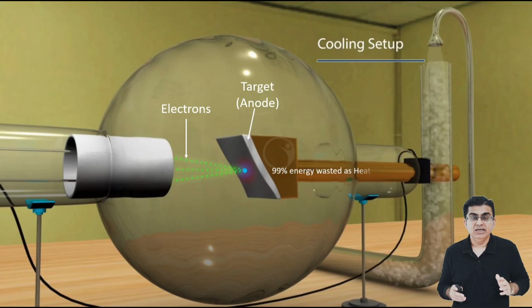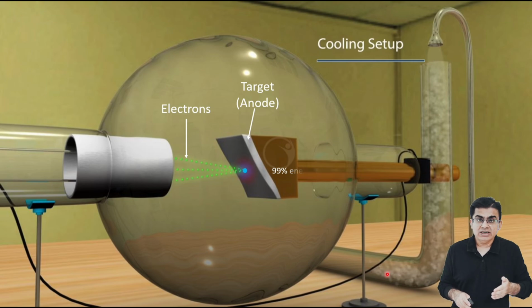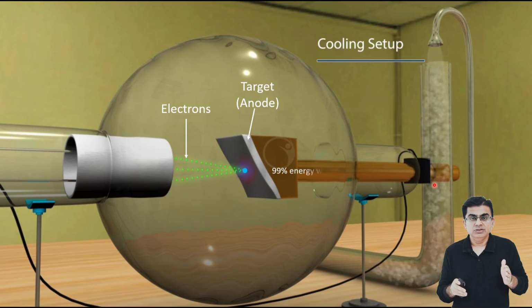The heat generated is so intense that we must use a rapidly spinning tungsten target, heavy thick copper blocks, and this special cooling water circulating system to remove heat from the tube continuously, all the time, as long as the X-ray tube is on.